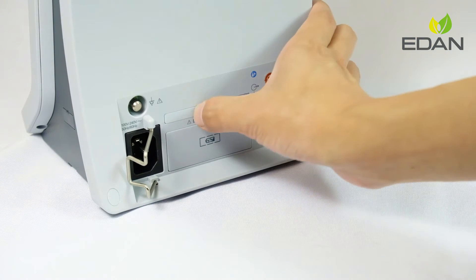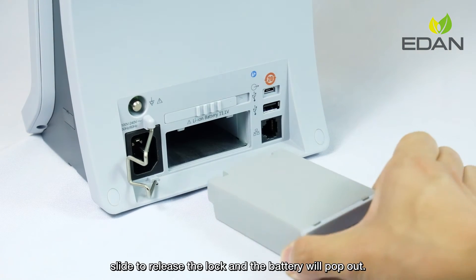To take out the battery, slide to release the lock and the battery will pop out.